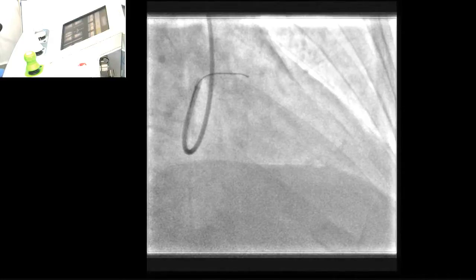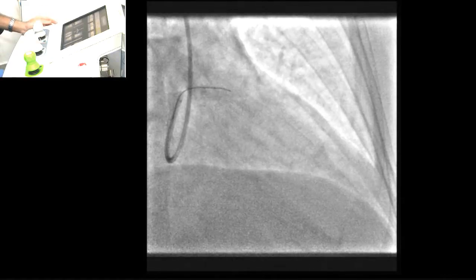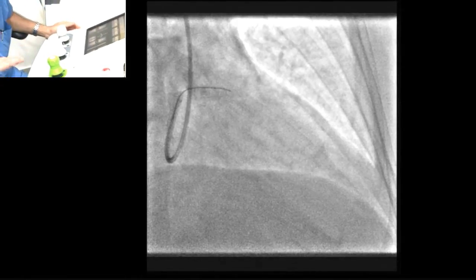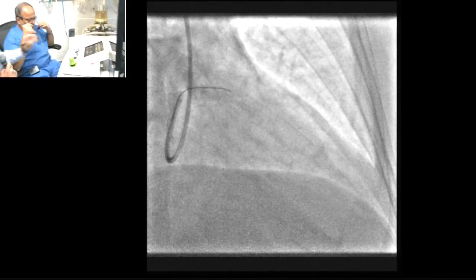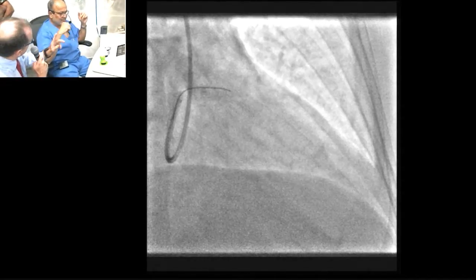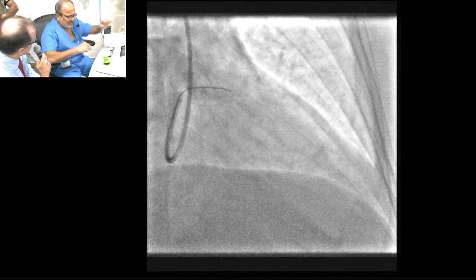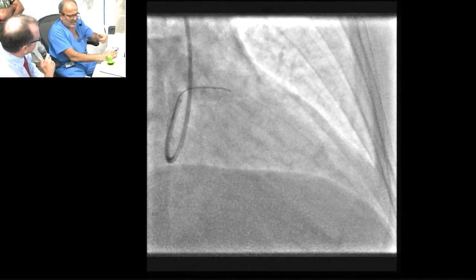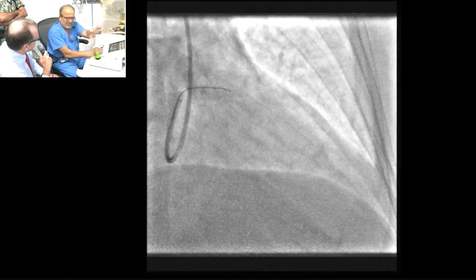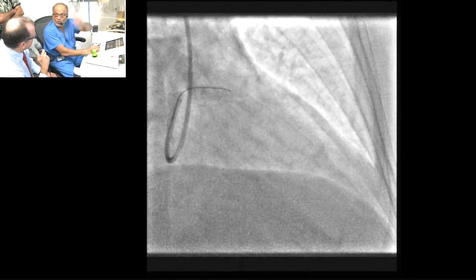You have also loaded the stent. One thing we were discussing at lunch: we were using the first version without the extra toggle for the guide. One thing we noticed is that there is a little bit of delay as you are moving the wire. Are you experiencing the same with this current version? If it is a straight segment, the wire follows the movement of the knob. But if it is a tortuous segment, then we have other tricks — I just go on rotating on one side and it moves properly.